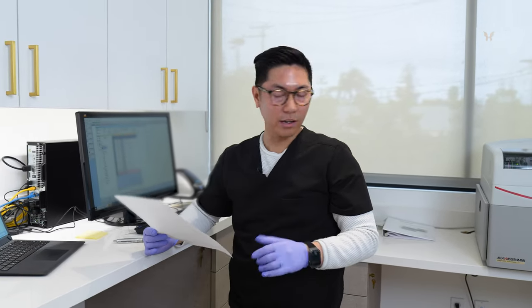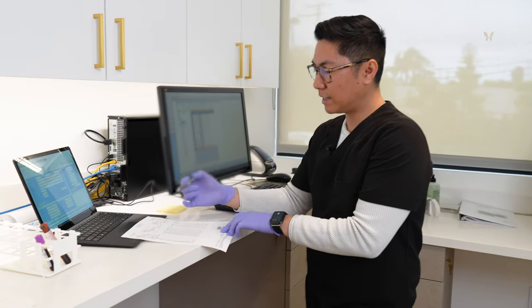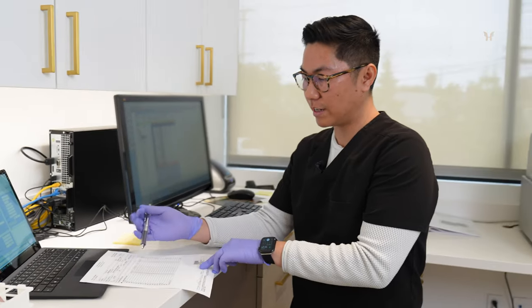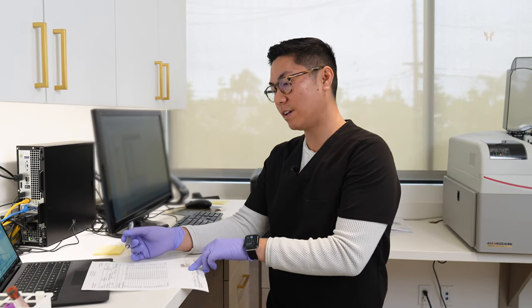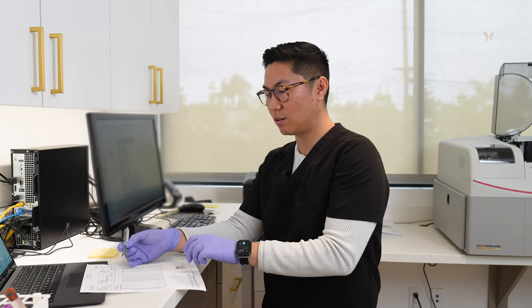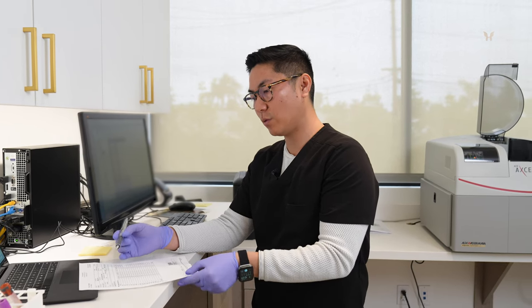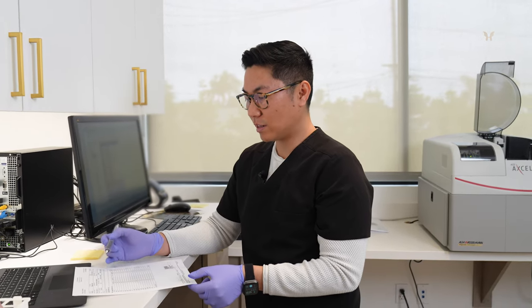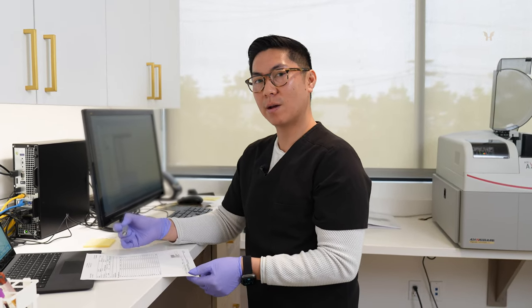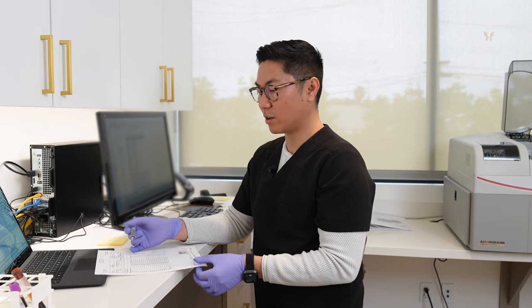While the other machine's going, I'll talk about the results we got for the CBC first. For this patient, everything came out normal — it's actually really good. The only thing I would flag is if there are any abnormal results; I'll let Dr. Li or the surgeon know, and then we can determine if they need to order any more testing. If I see something abnormal, I can rerun the blood, and since we're doing it in-house, it's a lot quicker.